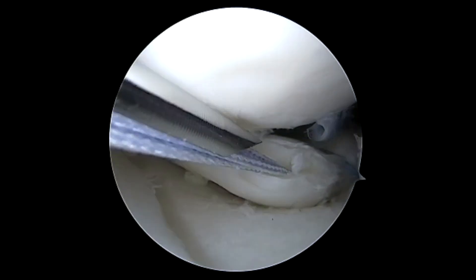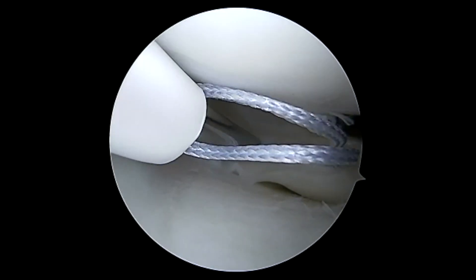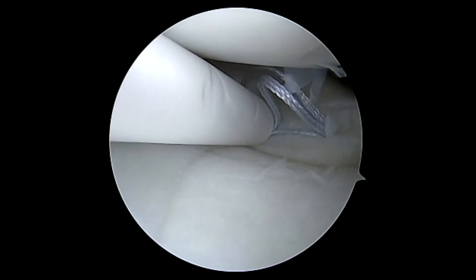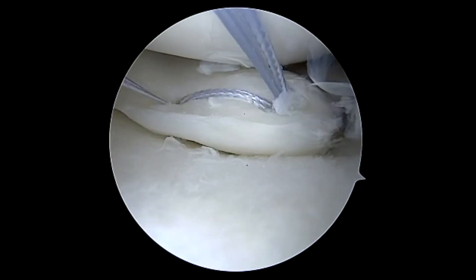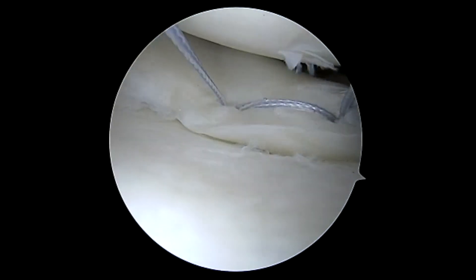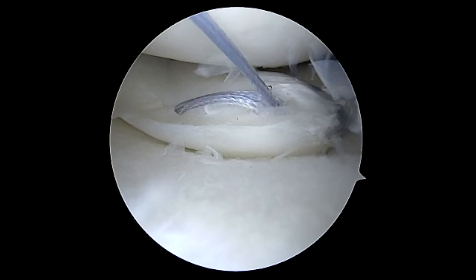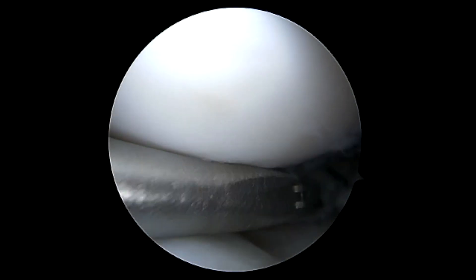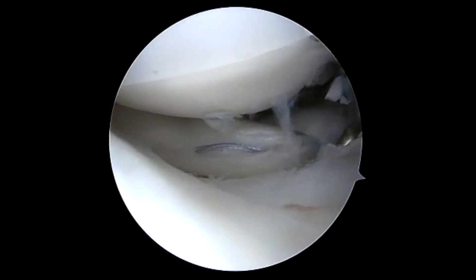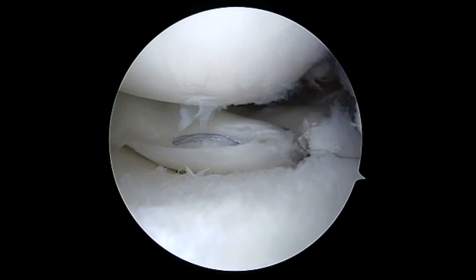Following this, we thought there was still some more mobility of the meniscus, as there was a small split tear at the red-white junction. We'll place a single all-inside suture to further cinch down the meniscus and reduce the hoop stress further. This has two limbs as an all-suture device. We'll cut it, and you can see that we've attached the meniscus to the back wall well, as well as to the root and the two ends together.